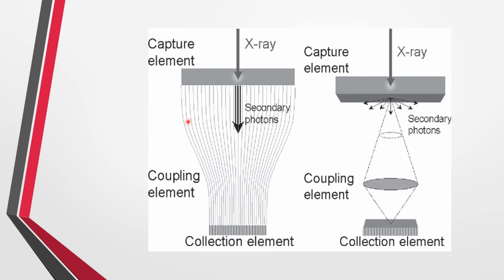It could be of two different types. Some don't have this coupling step, and that's of course with a direct type, but all the different manufacturers could make theirs in different ways. There's different phosphors, there's different technologies that they put into it.